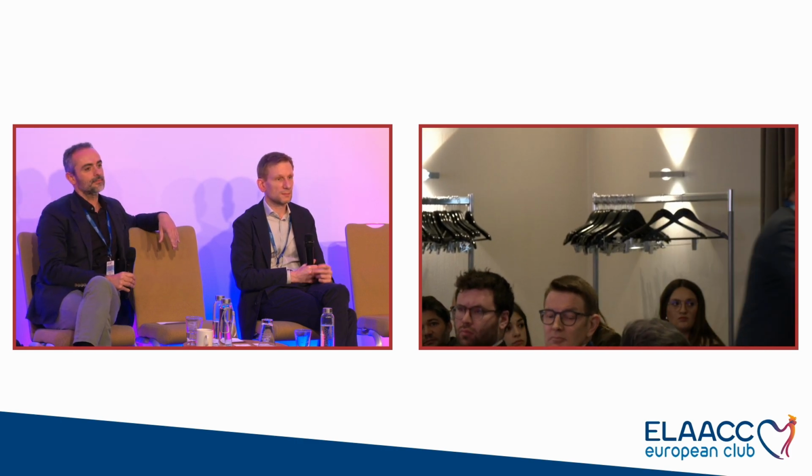Just a quick comment. I think that it's not fair to just rely on this monoplane because it was working in the past, because now we are closing appendages that have high contractility, they are more elliptical, and I think so. Now with the paroxysmal AF, at least what we saw in our center, is that we are closing less sick patients. And the thing is that, for example, I come from the imaging, for me to make a measurement in 135, I really don't know where to put the line.